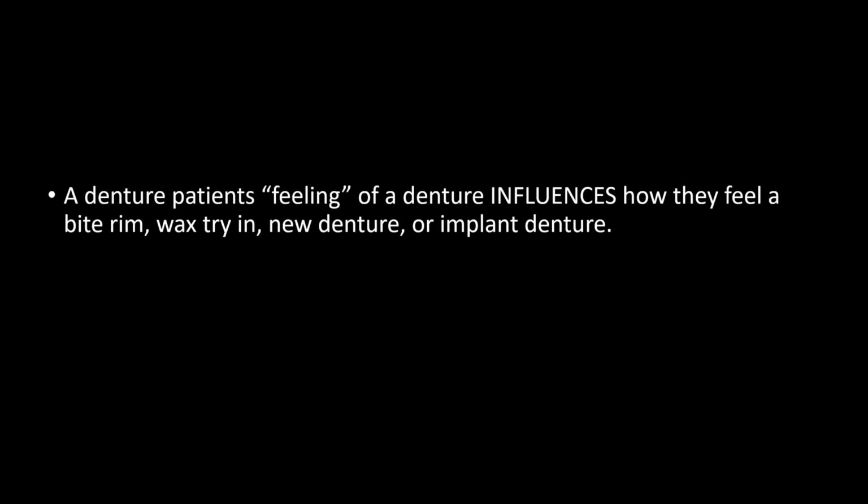So I craft wax rims much like a denture. The incisal edge isn't 5 millimeters thick, it's 1 millimeter thick, because that's what an incisal edge is. So I'm recrafting how I make a rim so that it doesn't act as so much change to the central nervous system when I introduce it into the mouth. Because remember, it's made from wax or such, and so everything I use in the office now is tailored to make it feel just like a denture.